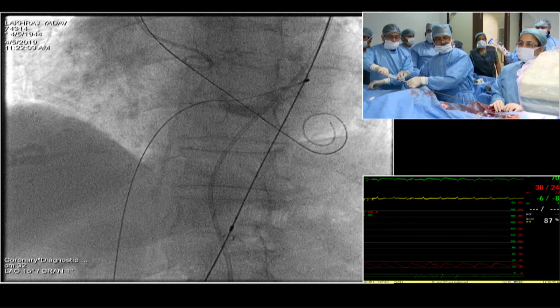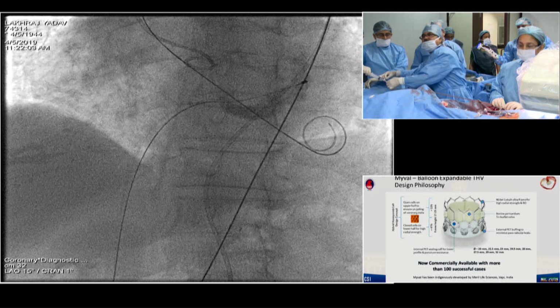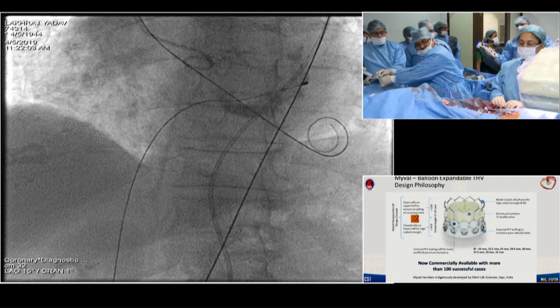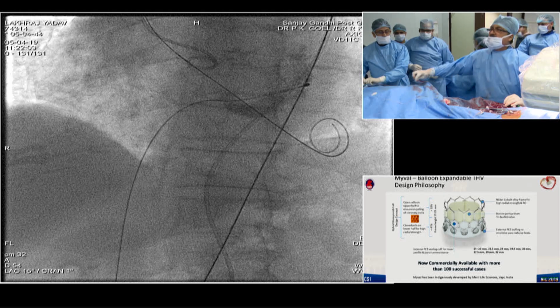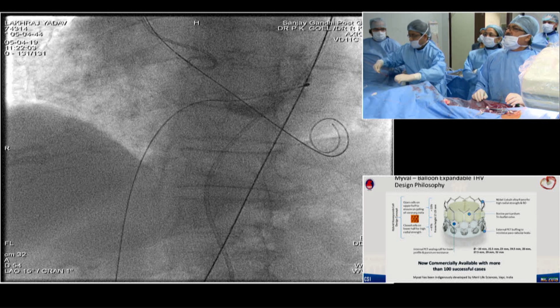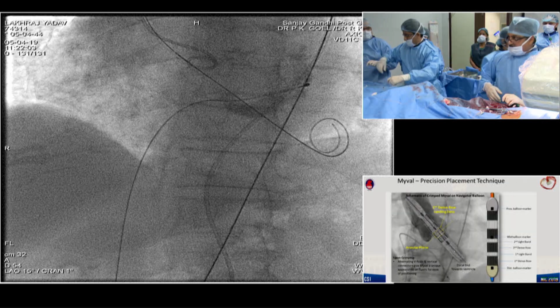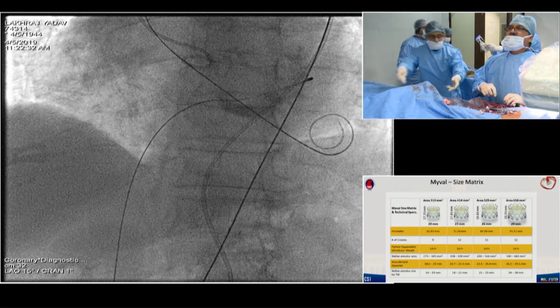The sheath has to be caught, yeah. Okay, leave it. I think you need to give some noradrenaline. Yes, the NORAD. Two concerns for sudden hypotension would be pericardial effusion, or some NORAD is needed.